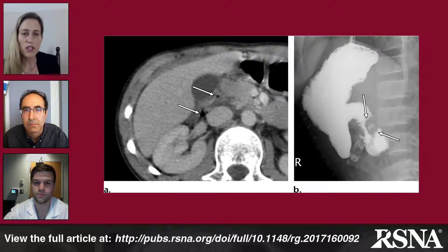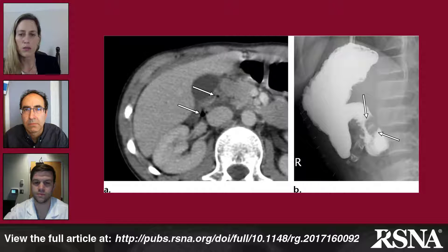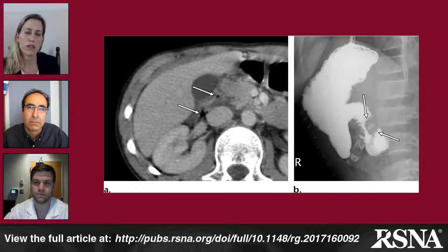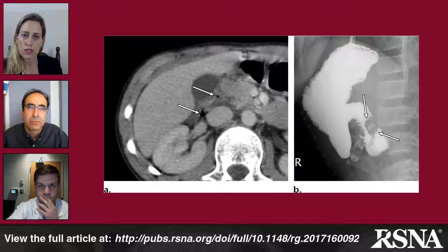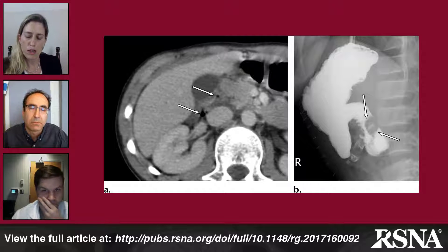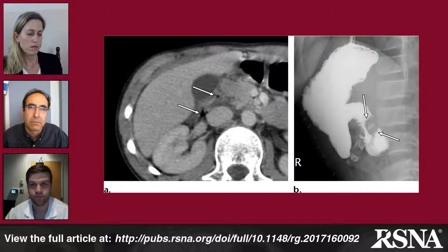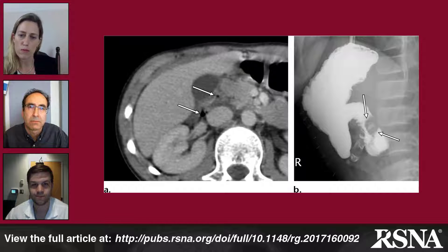The location of free air is something worth highlighting — it can be telling as to which portion of the bowel is injured. Retroperitoneal air would classically be associated with injuries to the second through fourth portion of the duodenum, and the ascending and descending colon. The remainder of the bowel is intraperitoneal, so the location can help distinguish which loop of bowel might be affected.